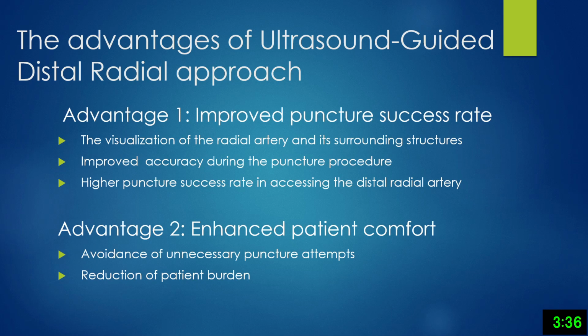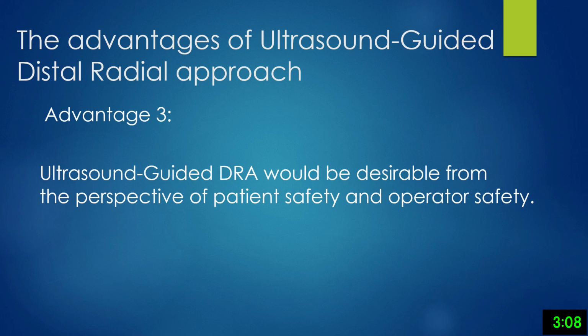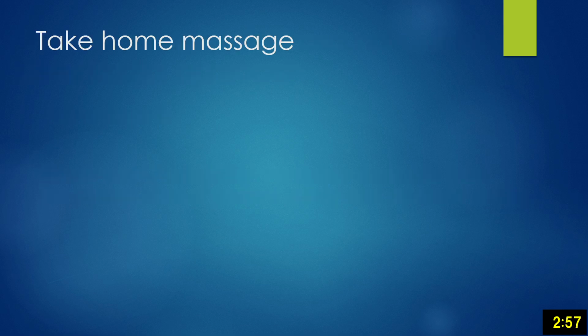The visualization provided by ultrasound guidance can help prevent unnecessary puncture attempts, resulting in time savings and reducing the burden on the patient. Above all, ultrasound-guided distal radial approach would be desirable from the perspective of patient safety and operator safety.